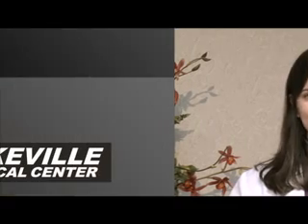One of those is that it prevents osteoporosis, because you're walking and weight bearing on your bones, so you're helping to keep them strong and prevent breaks down the road. It also helps with spasticity, which is a condition that often happens after a brain injury or stroke that causes your muscles to tighten down and limits your range of motion. So improving range of motion and reducing spasticity are some of the great benefits that the Lokomat can provide.